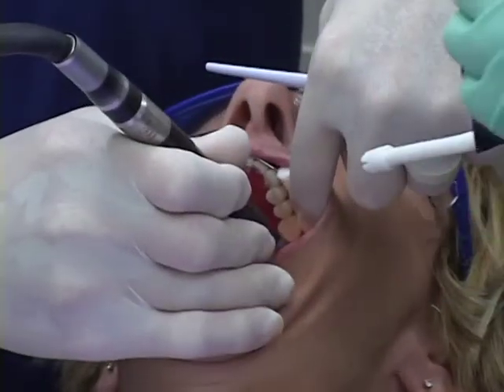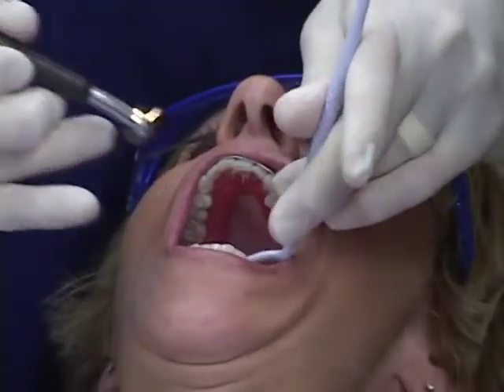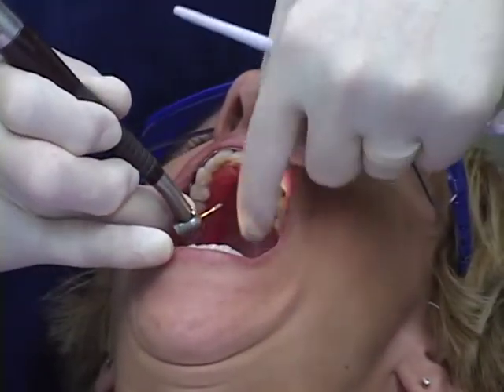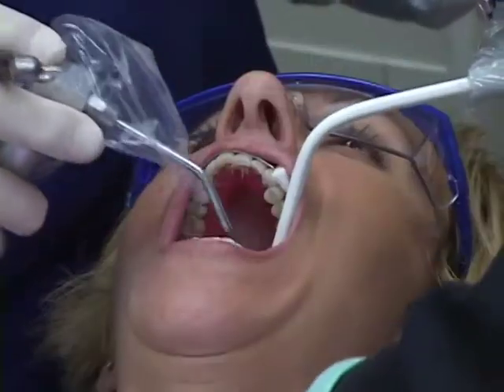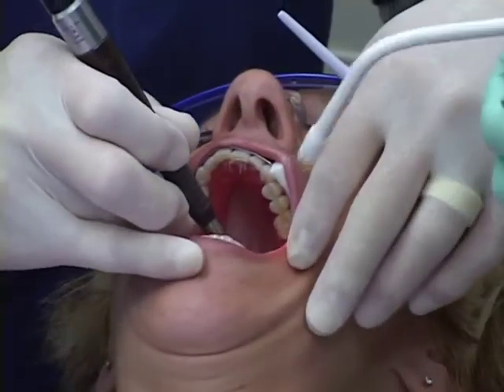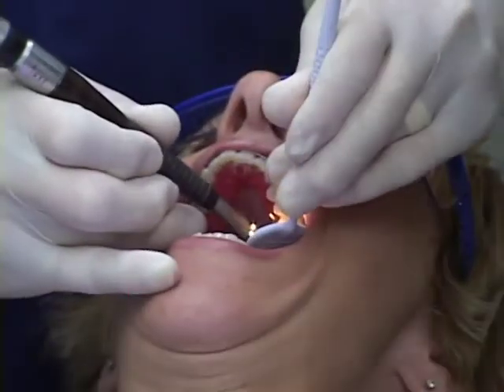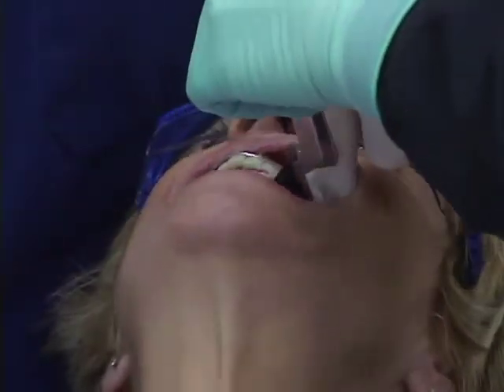Picking up a little bit on the number 15 and 18 here. Okay. Tighten it in there now, please. Okay, relax your tongue there. Good. Okay, go ahead. Stop again. Tap.